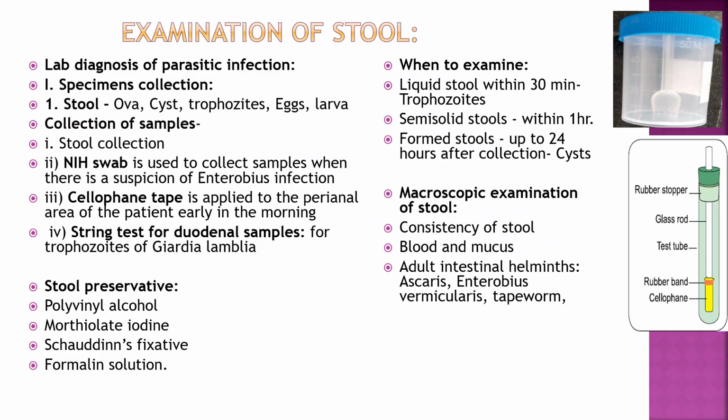Now, when to examine the stool sample? If the consistency is liquid stool, you have to examine it within 30 minutes, because in that we are examining trophozoites, that is motility of the parasites, trophozoites like amoeba or Giardia. Semi-solid stool we can examine within 1 hour, and solid or formed stools up to 24 hours after collection, because in that we see mainly cyst forms. In semi-solid we can see both trophozoite and cyst forms.